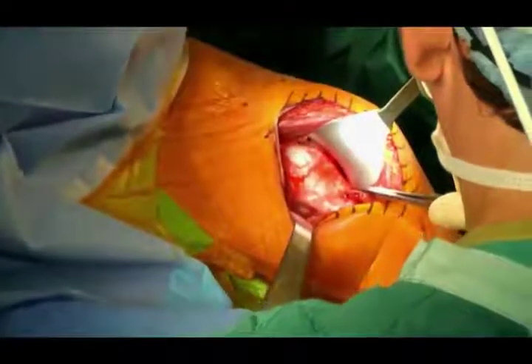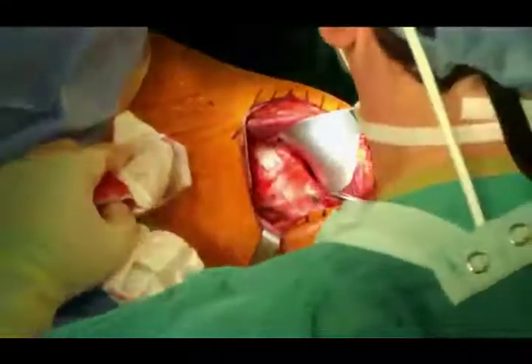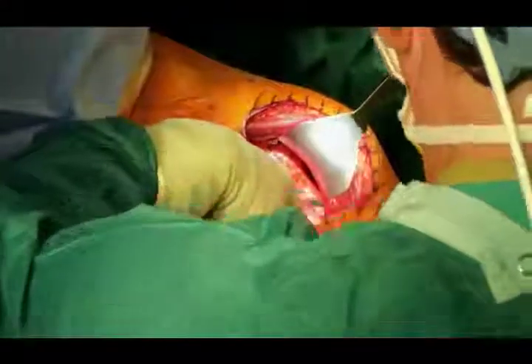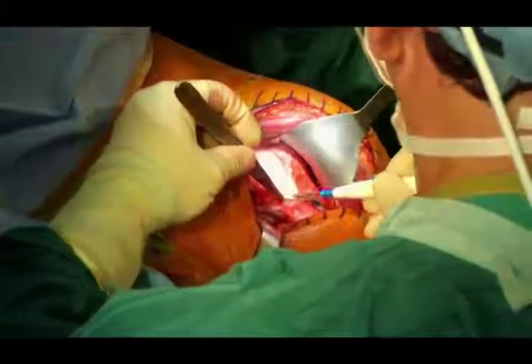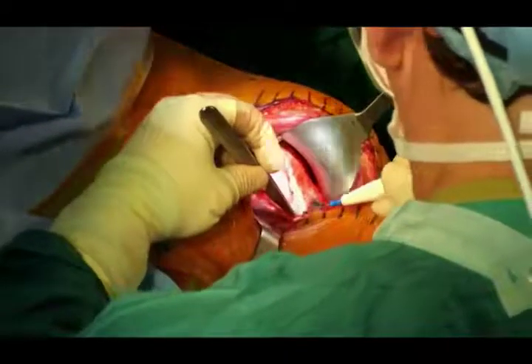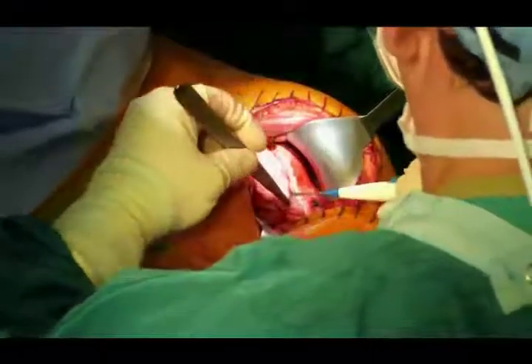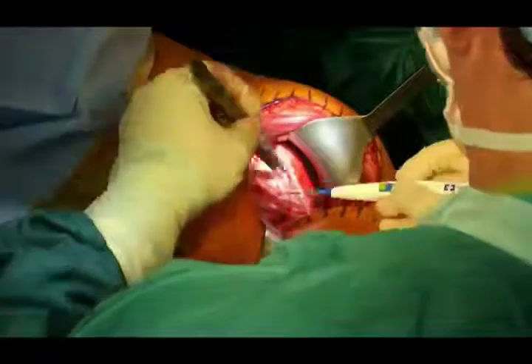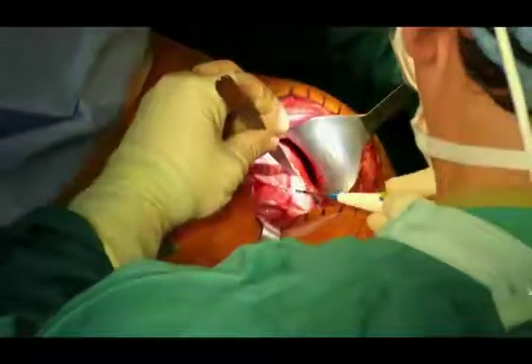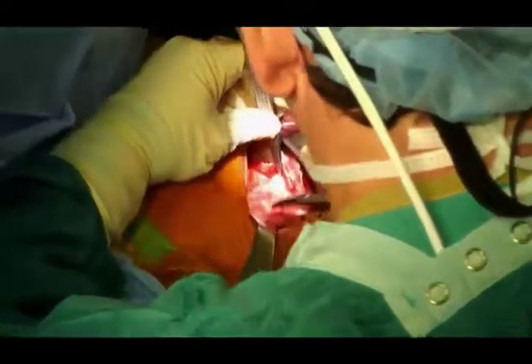For reverse shoulder, I actually do release the coracoacromial ligament — it helps with exposure and helps place the match point guide. This case is interesting: I did his other shoulder previously, and I placed the glenoid component a little too high, which caused impingement during trialing. So this time I used the match point patient-specific planning system to plan the operation ahead of time to limit the chance of malpositioning the glenoid component.